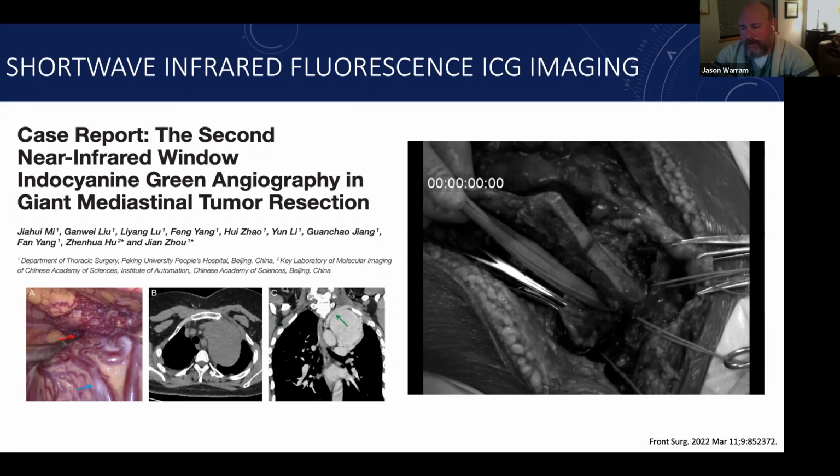The thing that UPenn is doing is they're taking advantage of the tumor's enhanced permeability effect to retain this ICG. That's just free ICG, but it's pooling in the tumor. And when you give a large bolus of that ICG over time, it collects and it doesn't wash out as fast as the surrounding tissue. And so at 5 mg/kg at 24 hours, they found that they've achieved a great deal of contrast. Now, we could talk about the specificity of that contrast, particularly in GBM, and then they're doing it also in thoracics and perhaps others.